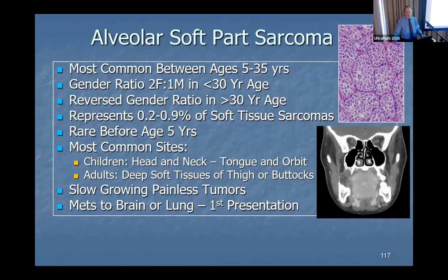So this is what they were expecting with the last patient, and of course, it did not have that. And when you look at alveolar soft part, typically it has a classic appearance, but sometimes it can be very pleomorphic. That was another reason to do electron microscopy to prove that there were none of these rhomboid structures in there, or even some pleomorphic-looking sort of rhomboid structures.